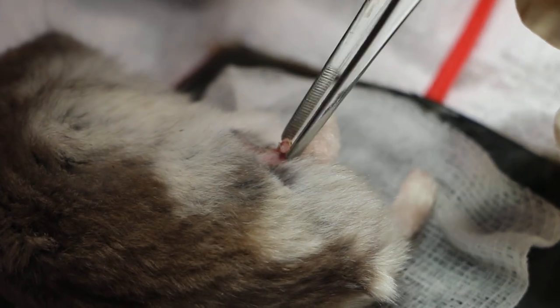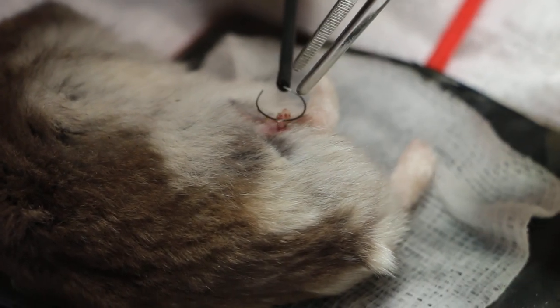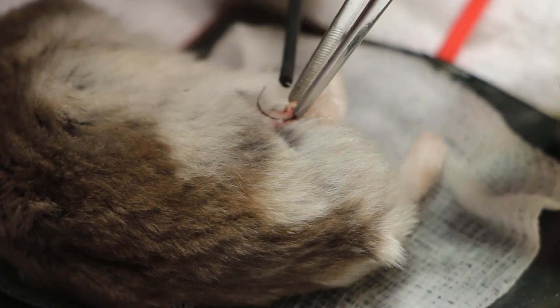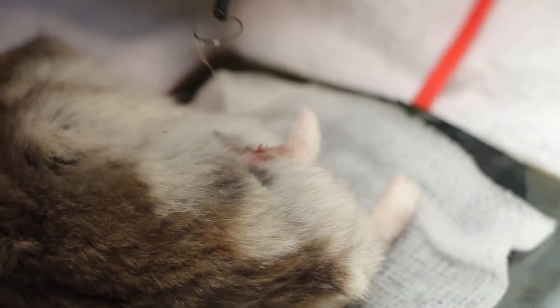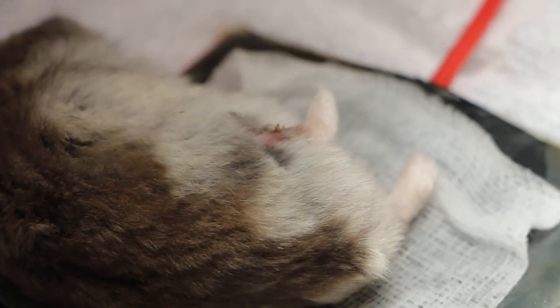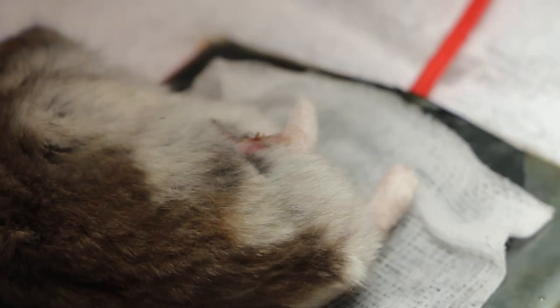We have to put anesthesia again so that I can check. Now you can see this circular wire, it's a bit broken or disconnected but it's okay. Now we check again. There is still a bit, so I will go under again. It's finished. We make sure that there is no bleeding. If there is no bleeding, then there is no need to put potassium permanganate. Although sometimes it might bleed later.